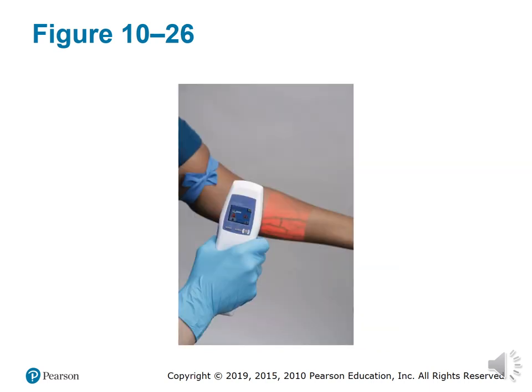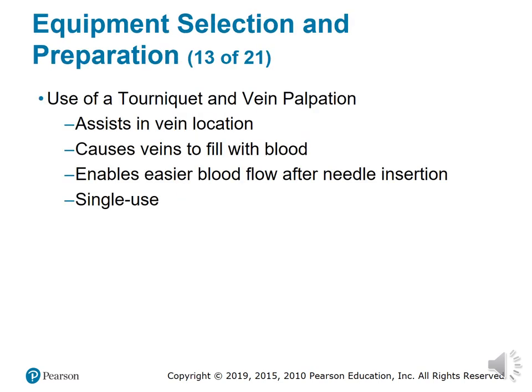All right. This is the AccuVein. It uses infrared light to identify the veins. Again, no, we do not have these. And no, you will not get these. All right.